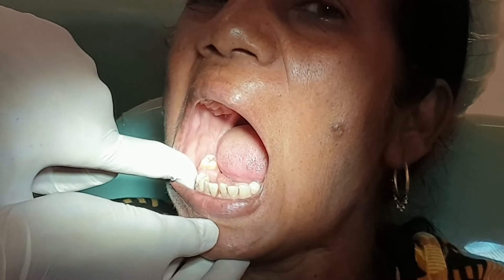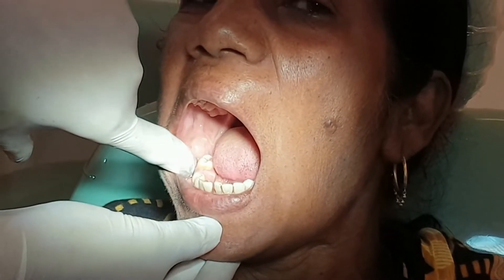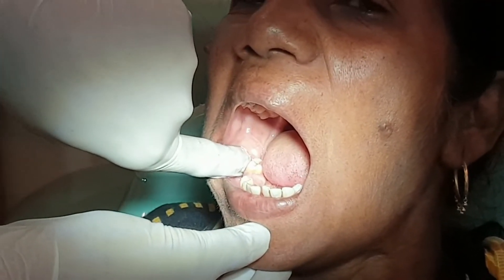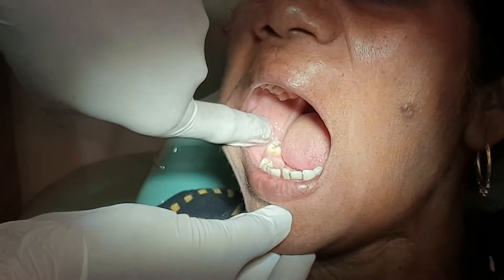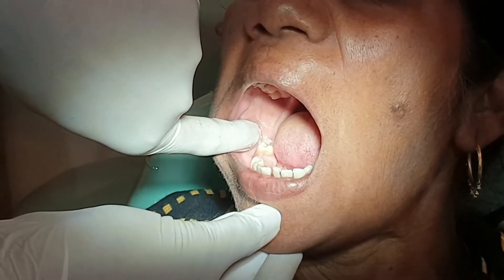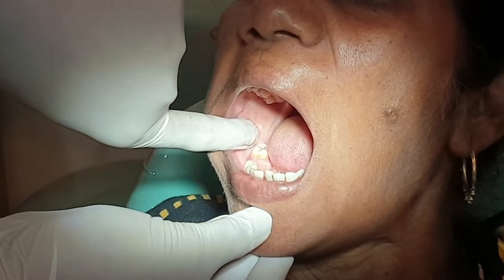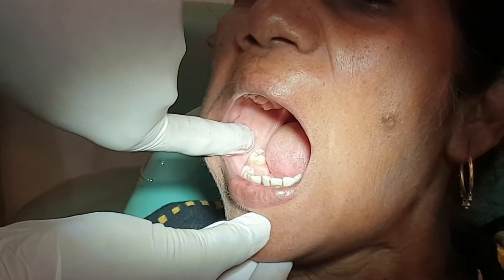We begin by palpating the mucobuccal fold in the premolar-molar area. As we go posteriorly, we palpate the External Oblique Ridge, which continues posteriorly as the Anterior Border of the Ramus. On the Anterior Border of the Ramus, the finger is moved in an up-and-down direction to locate the Coronoid Notch.